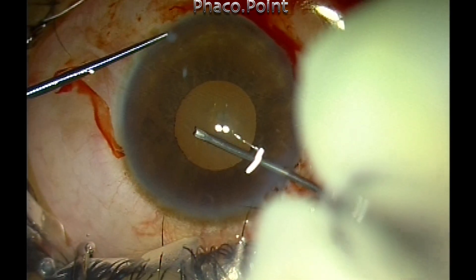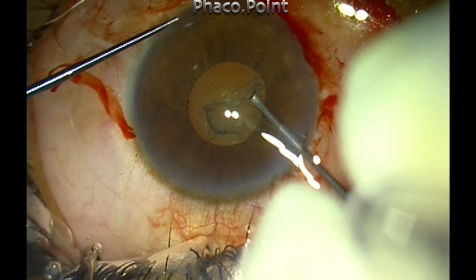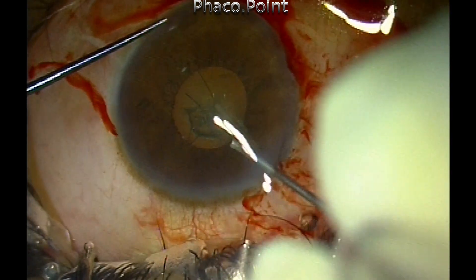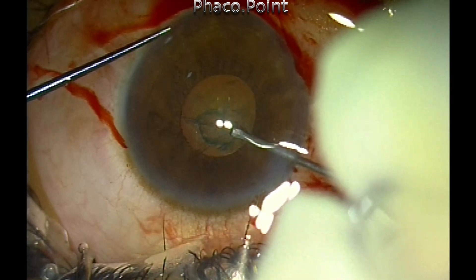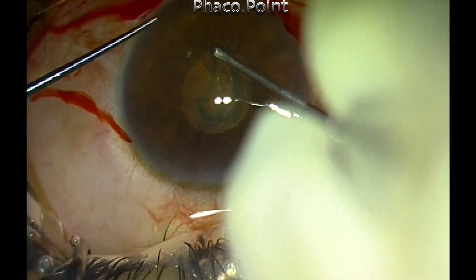The trick is to perform a capsular rhexis that is slightly larger than the pupil diameter. Therefore you need to carry some part of the rhexis at least behind the pupillary plane, and then with careful control of the capsular rhexis you should be able to complete it.